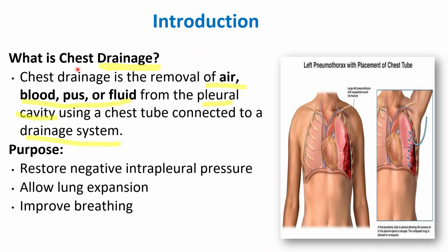Once again I repeat, chest drainage is the process of removal of air or blood or pus or fluid from the pleural cavity using a chest tube which is connected to the drainage system.